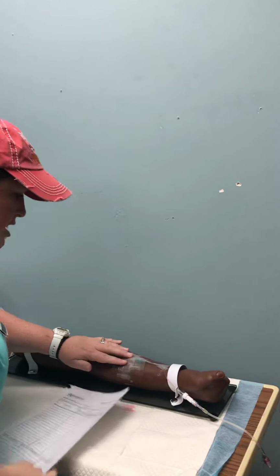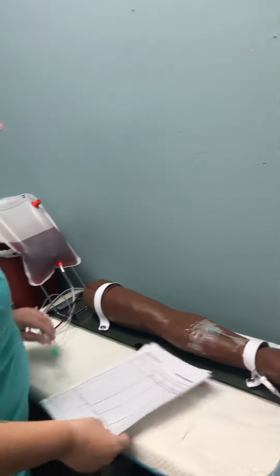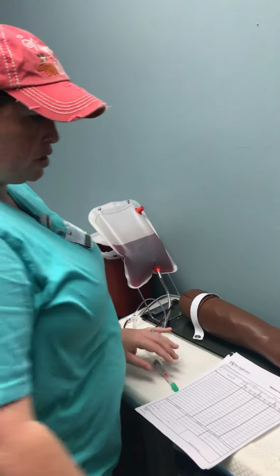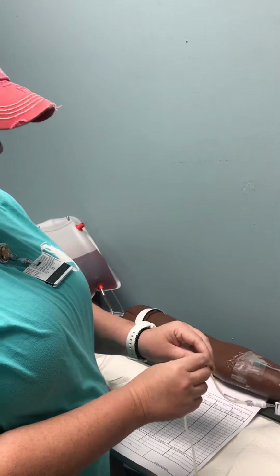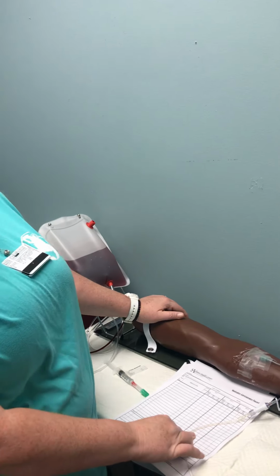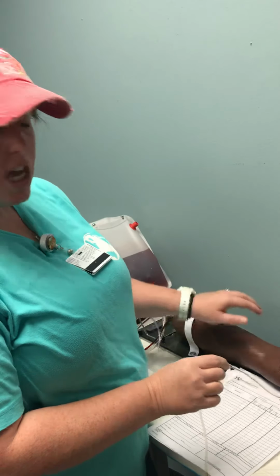I'm going to check and make sure the IV site is still good. And it is. We have no redness or irritation or drainage or anything, so it is good. Our patient has no allergies, and now we're going to administer our medicine to the closest port to the patient. We're going to give our medicine to our patient because he has pain. He says his pain was a 7. So we're going to give him this medicine because his pain is a 7.